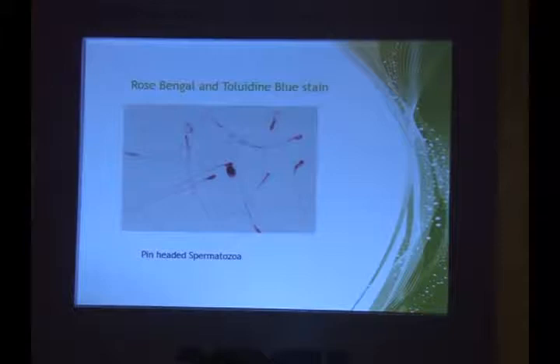This abnormality is very unique. Somebody who has all pinhead sperm will have more than 90-95% pinhead sperm. So these are sperm heads without any nuclear content and only one sperm, but again not normal because it has a bent midpiece.